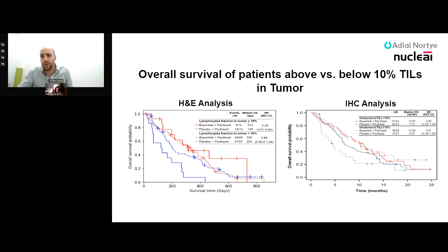So this was a very good litmus test to say that, yes, the model that we built is not only comparing to the gold standard of the pathologist reading of what these tumors show, which we showed earlier with the correlation, but not only that, we can now find and identify and confirm similar biomarkers that we know would work if you were to use a traditional biomarker. So then it allows us to take the next step and say, what else could we learn from the H&E that you would not have, or easily, readily have available, in the traditional biomarkers?